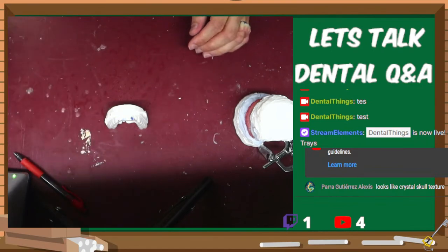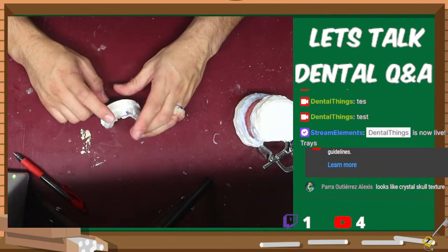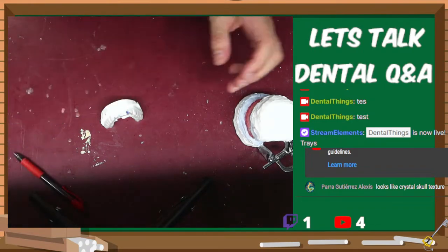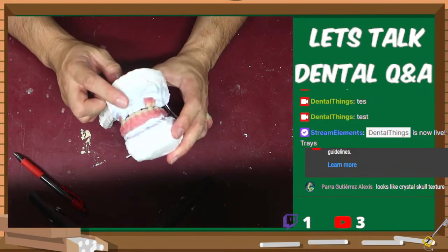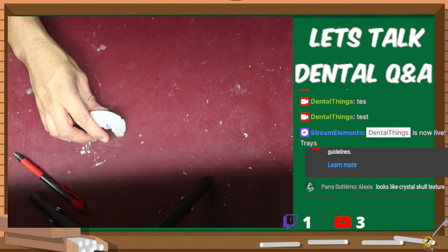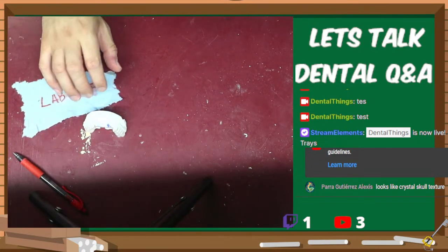Now that I have my set, let me prep my lathe, which is like 2 feet in that direction, and then we'll get a nice little polish. That'll take a couple of seconds, and then I can show that off to my patient, and then I'll start working a little bit on this denture that I've been working on on and off for a little bit. So let me get this prepped and lab stuff.